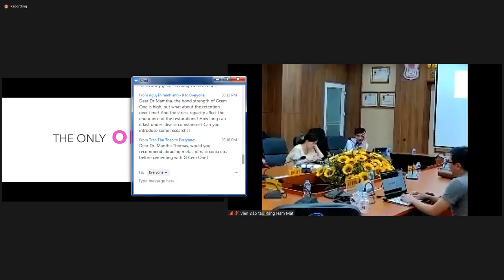So GC has all the pre-treatment in that one bottle called the G-Multi Primer. But in case you don't have that, what you need is a silane coupling agent for glass ceramics. Now, if it is a zirconia, like I said, you have to do sandblasting first and then apply MDP. So likewise with metal and any other substrates, depending on the manufacturer's instructions, and largely it's either metal or ceramics or hybrid. So you have to follow either the etching with hydrofluoric acid or the sandblasting, followed by silane or MDP.